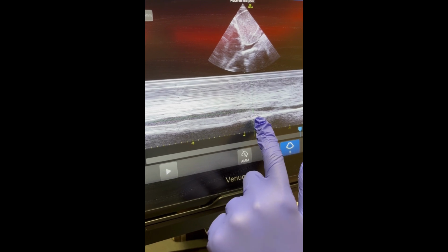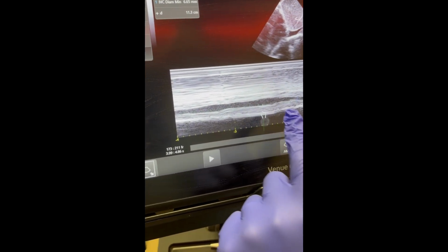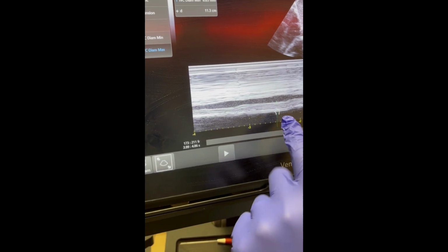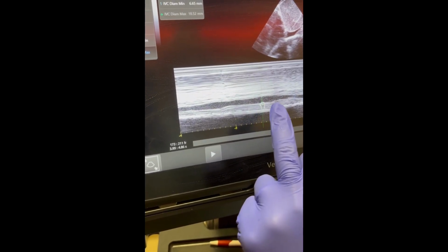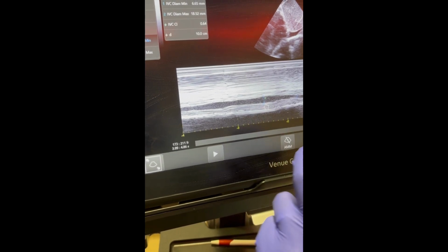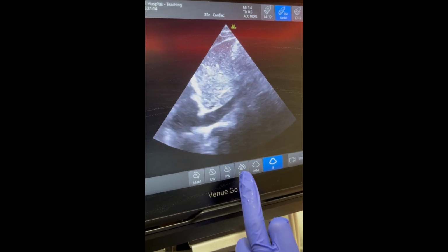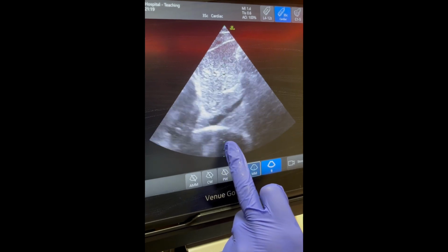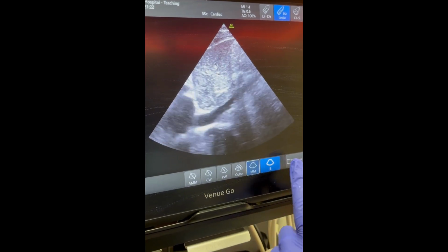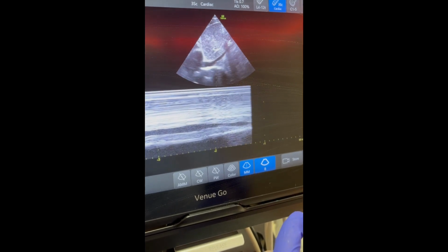As you can see here, the IVC that I have on this video is slightly diagonal as opposed to more horizontal, which is important when it comes to the measurement of the diameters of the IVC, as having a more diagonal IVC could lead to an overestimation of the diameter and therefore the erroneous assumption that the patient's volume status is on the higher side.